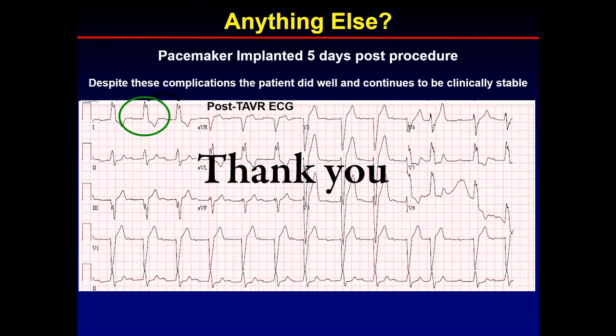I don't know. When we look at 30 days, it looks much more pronounced than at 1 year, and we saw less at 1 year as our patients continued to be followed. In terms of impact on gradient or clinical events, there was none. So it is something that is not pleasant to see. You see it probably more in the balloon expandable than the self-expanding, but I don't see any clinical implication of that so far.